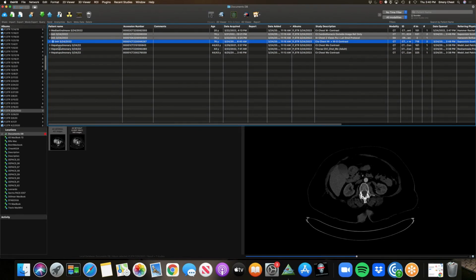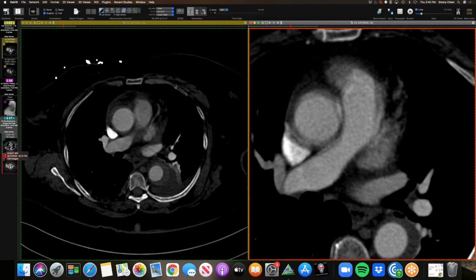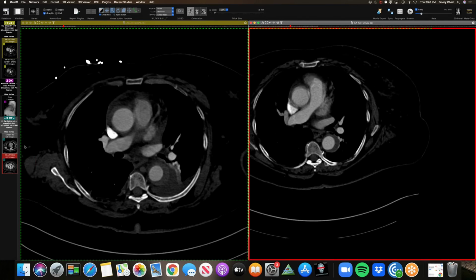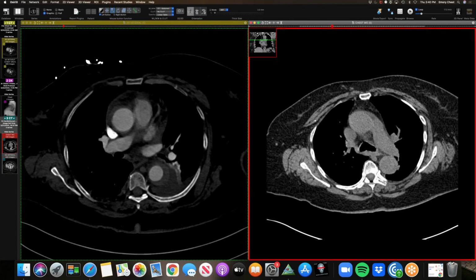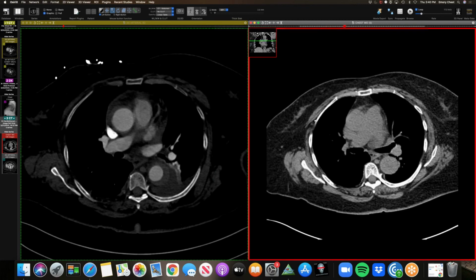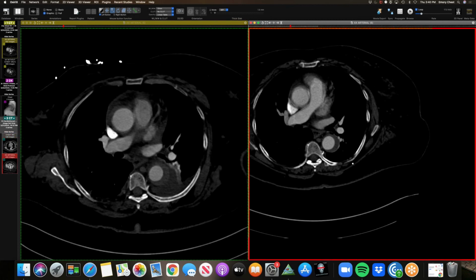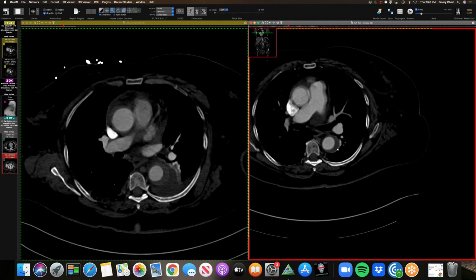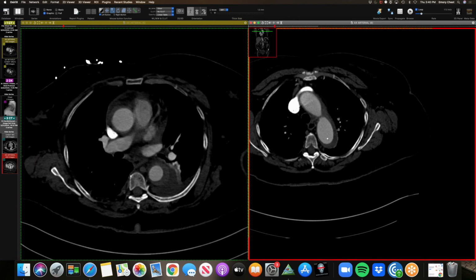This is a case I had earlier today. So it came in, and let me zoom out. So we have 2 scans. One was done at the outside hospital before it was referred to us. In our chart it was called a type B intramural hematoma, and the second year resident, when she was showing it to me, said, I think this is a type A intramural hematoma, and we looked at it.